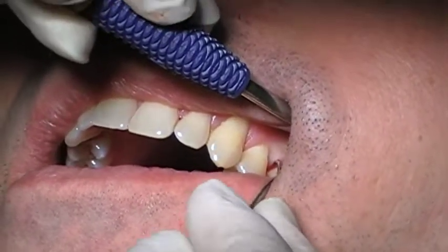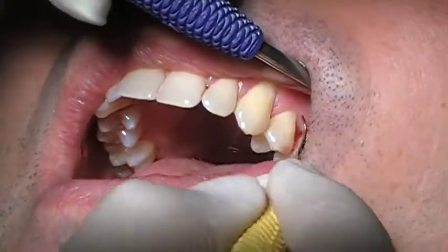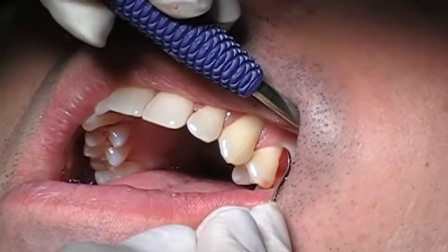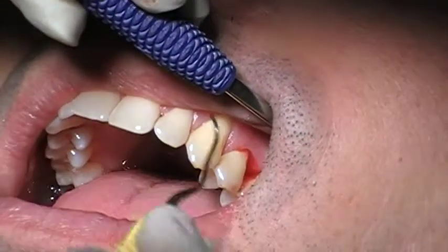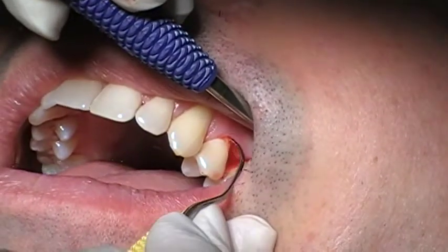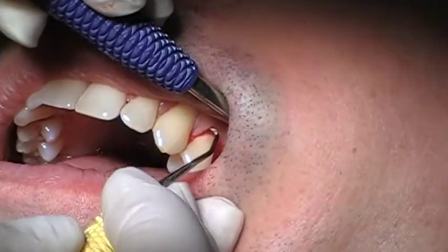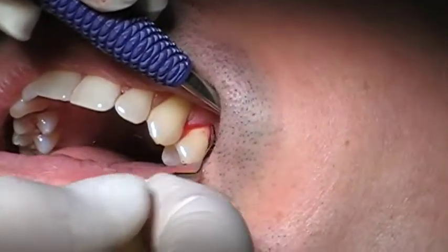Tooth number 12, distal line angle insertion at zero degrees. Keep that toe one-third adapted to the root. I'm using an external fulcrum, and I'm going to roll at the mesial line angle and come back and smooth that interproximal. A little bit of calculus that I'm smoothing.